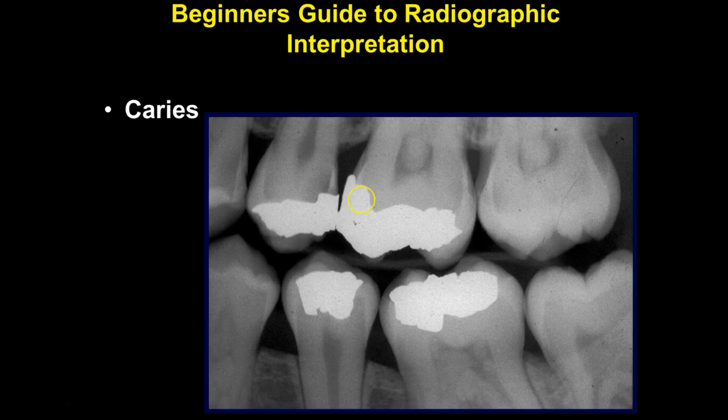Here we look at this image. It's a very good image as far as the interproximal spaces are open wide. We have some decay. We've got a possible class 2 to 3 lesion here that we need to be aware of. It looks suspicious, with the shadowing here. We've got some radiopacities that are localized. This is possibly maybe an older person. We're not quite sure. Sometimes they call these enamel pearls, but that is determined by the physician also.